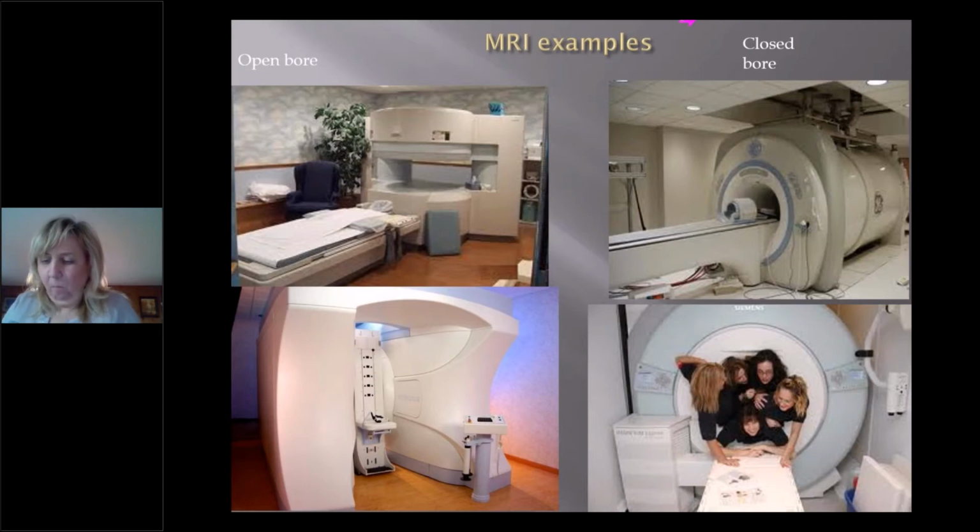If possible, get the open bore magnet or even a closed bore if the patient will tolerate it. These bottom ones, I really try to limit utilization of those. The technology is just not that great. The concept is wonderful, but the pictures are just okay. They're C plus on a good day.